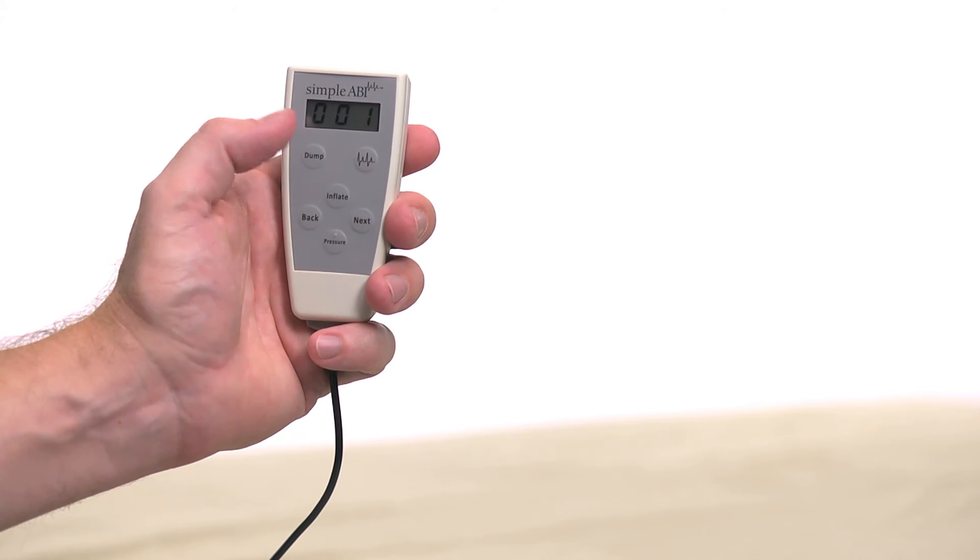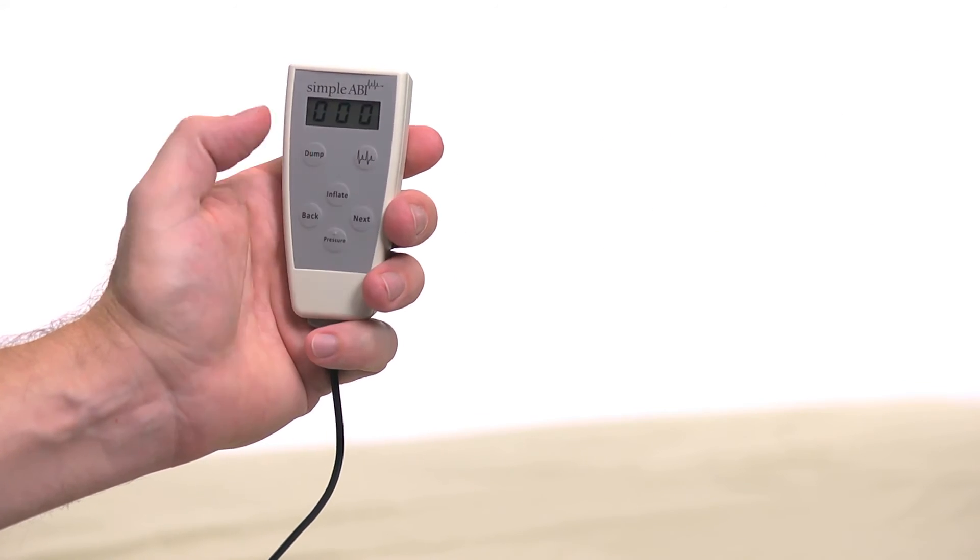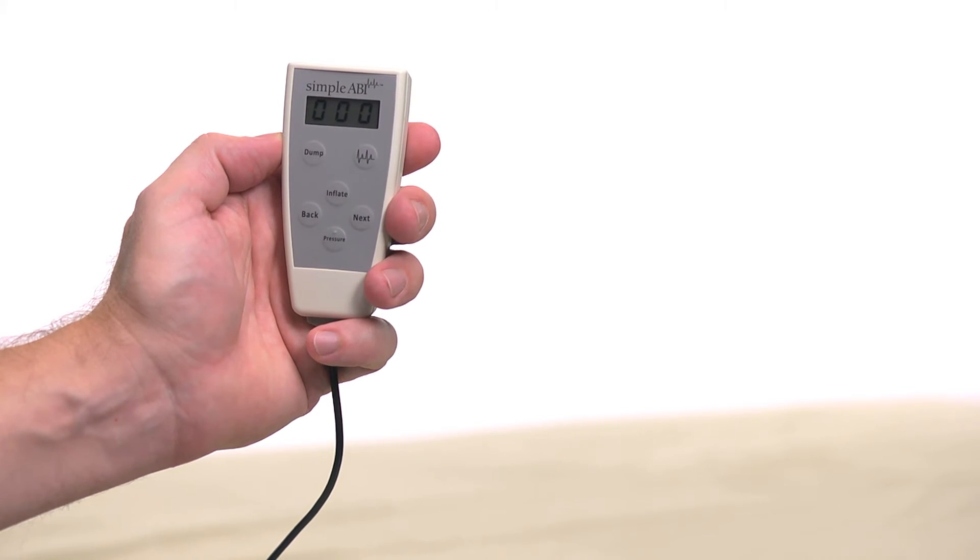When satisfied, press Next on the remote and the system will move to the dorsalis pedis, or DP. Please note: pressing Dump or Next will dump the pressure in the current cuff.